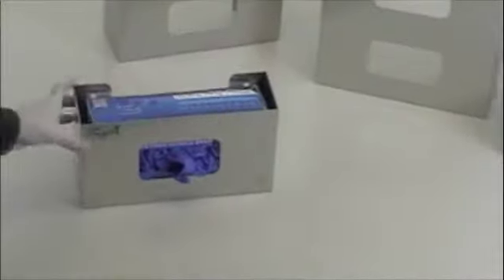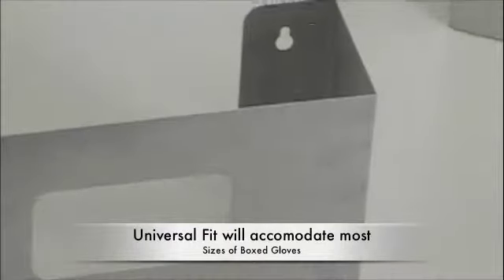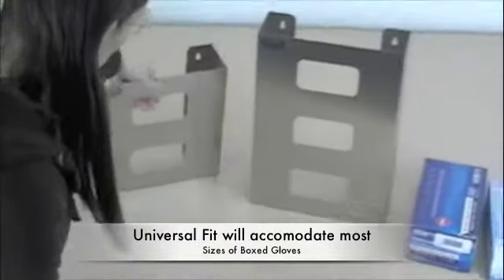so it's resistant to corrosion, it's antibacterial, and 100% recyclable. It's also non-magnetic, so these are safe for MRI labs and MRI facilities.